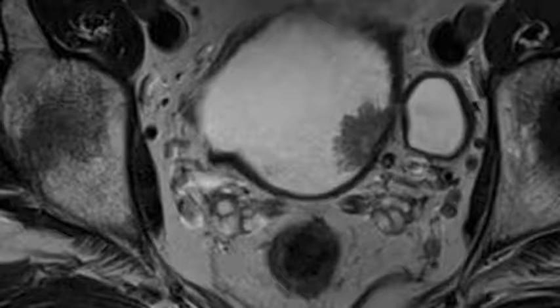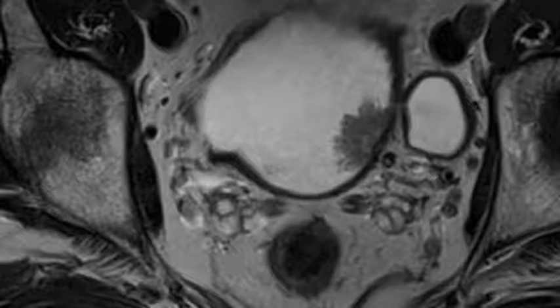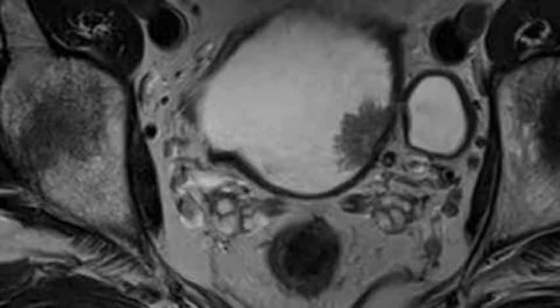Non-fat saturated fast spin echo T2 weighted images are obtained in the three standard orthogonal planes. The plane of acquisition perpendicular to the bladder mass allows optimal depiction of the relationship of the tumor to the underlying detrusor muscle. High resolution fast spin echo T2 weighted images of the bladder obtained in the three orthogonal planes with a small FOV and a large matrix are used to evaluate the detrusor muscle for tumor depth and invasion of the surrounding organs. The detrusor muscle appears as a hypointense line on T2 weighted images.